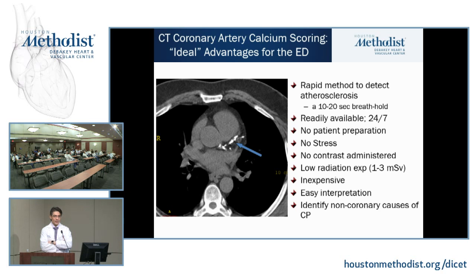In general, when you detect calcium, you're detecting at a ratio of 1 to 5 of the non-calcified plaque that's also present. So, there's 5 times as much non-calcified plaque present for the score that the patient has. So yes, he has some non-calcified plaque, but he may very well have a lot of non-calcified plaque.